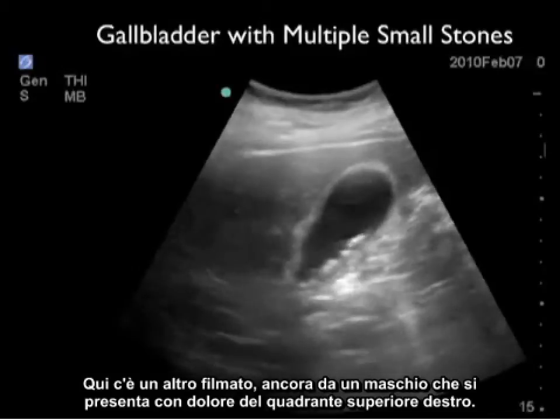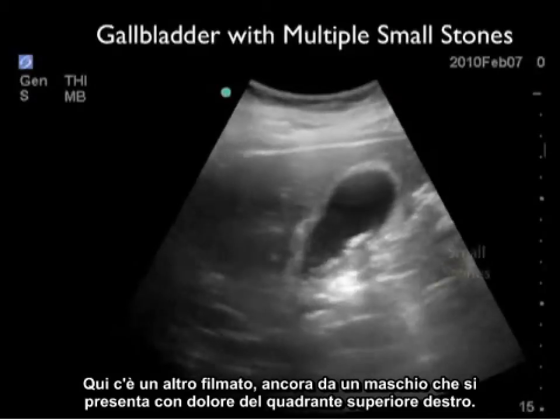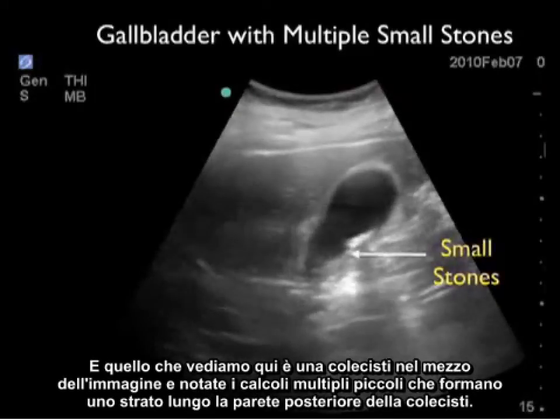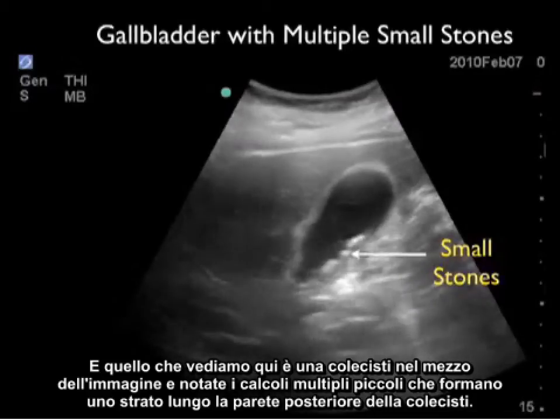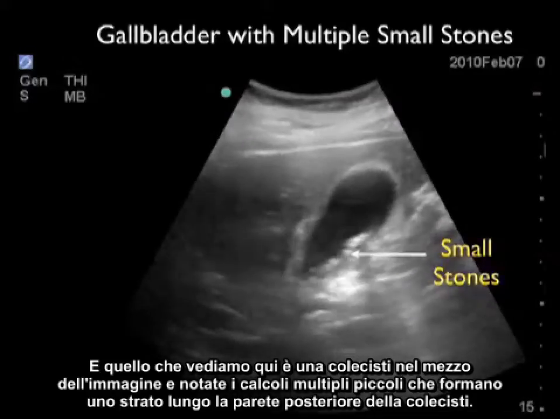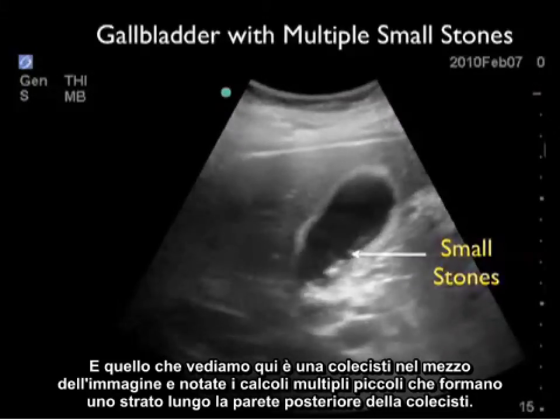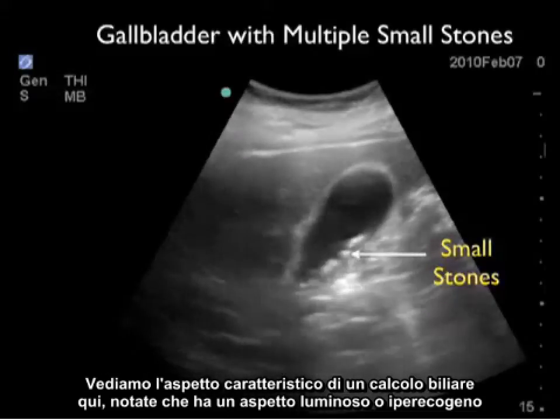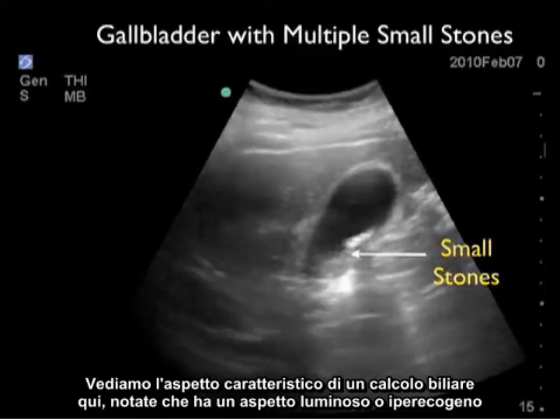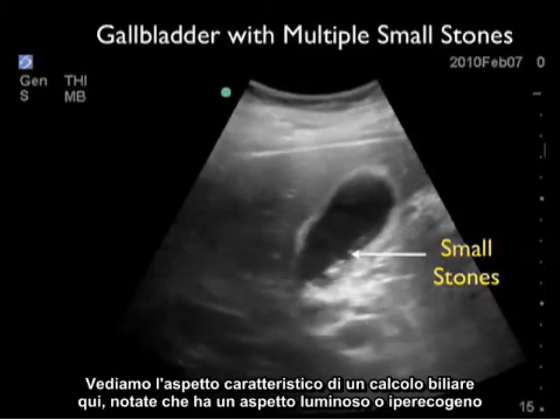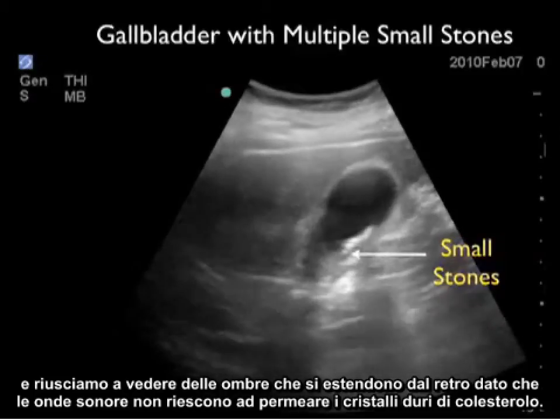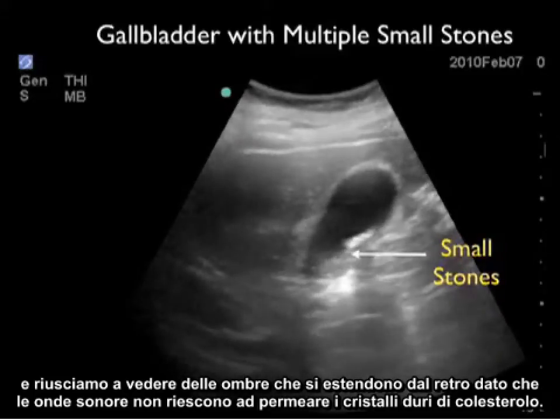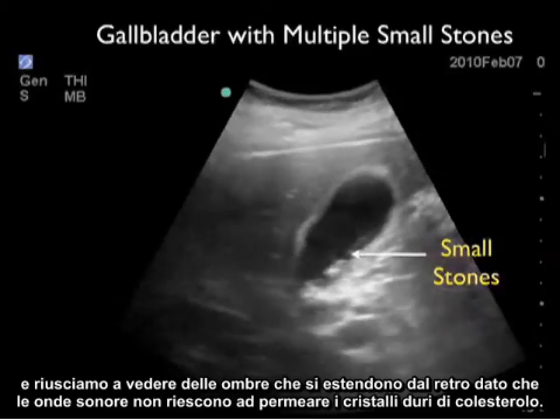Here's another video clip from a male presenting with right upper quadrant pain. We see the gallbladder in the middle of the image, and notice the layering of multiple small stones on the back wall of the gallbladder. We see the characteristic appearance of a gallstone: a hyperechoic or bright appearance, with shadows coming off the back as the sound waves cannot permeate the hard cholesterol crystals.